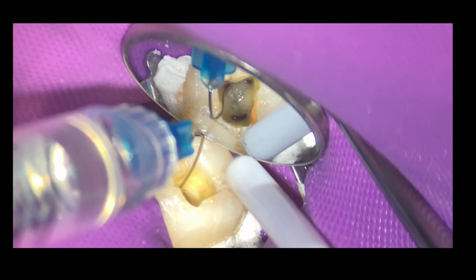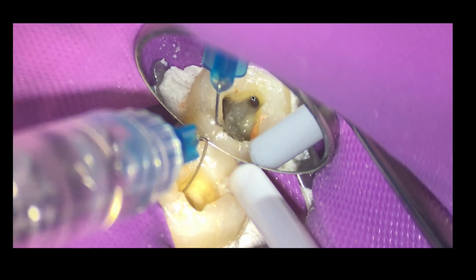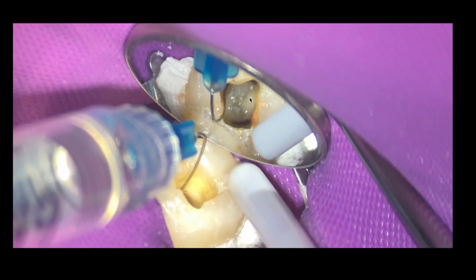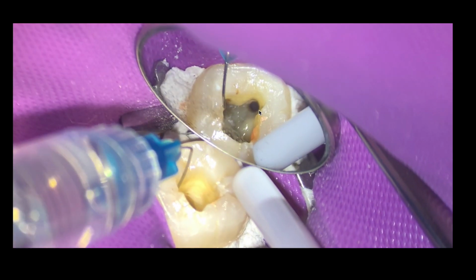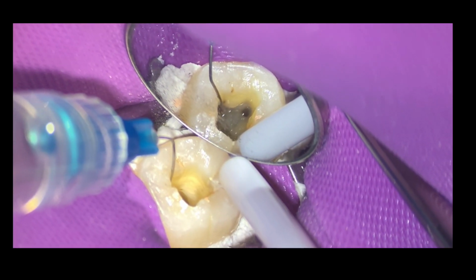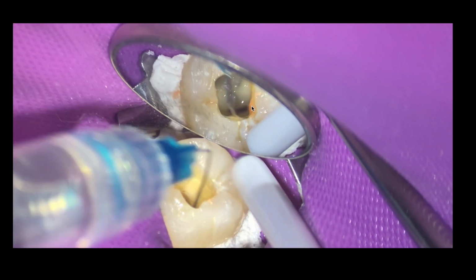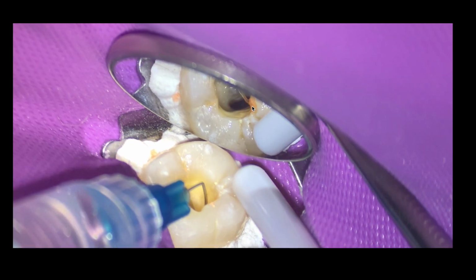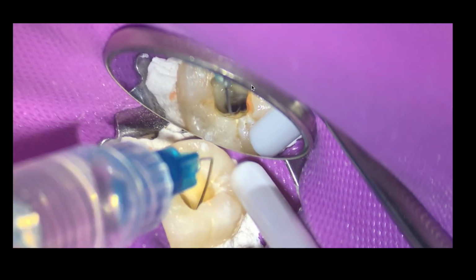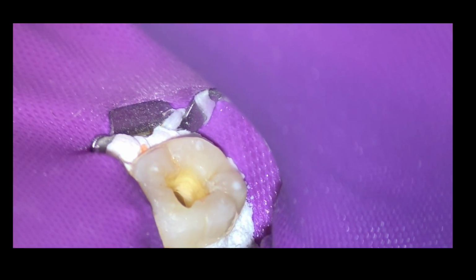Okay, so what we're going to do here is I'm just checking. Oh, it's like a smiley face. I should screen capture that. So there's a smiley face, and then we're going to aspirate my irrigant so it does come down and out of the mesial buccal. Now I feel a little bit better because now, boom, I've cleaned out a little more of that area between the mesial buccal and mesial lingual. So let's keep on trucking here.